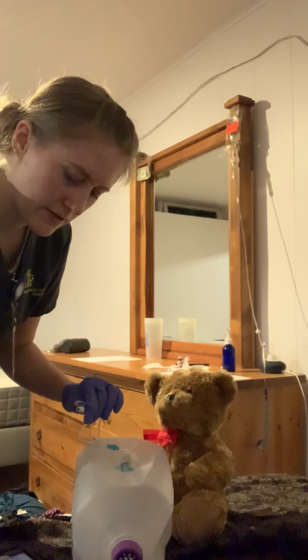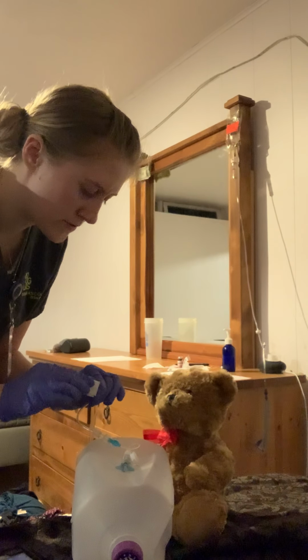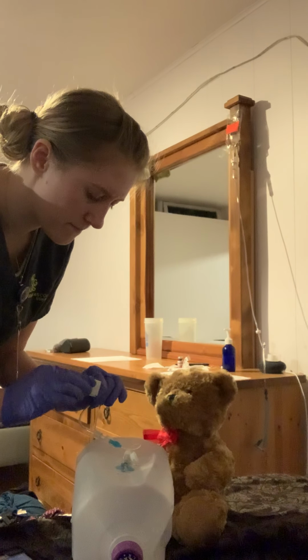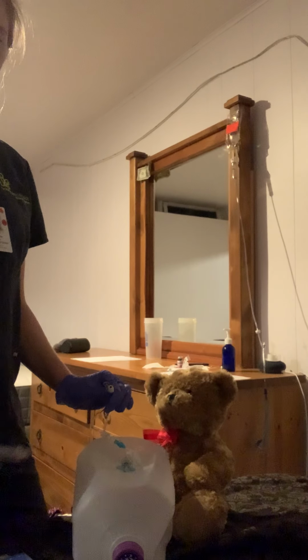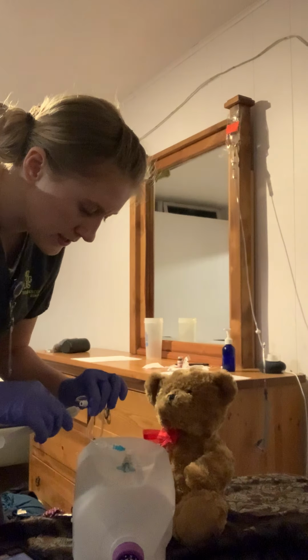And now we're just gonna prime it one more time. So again, just wiping it with the alcohol swab, circular motions for 15 seconds. And then just letting it dry. Now we'll use our second primed normal saline.